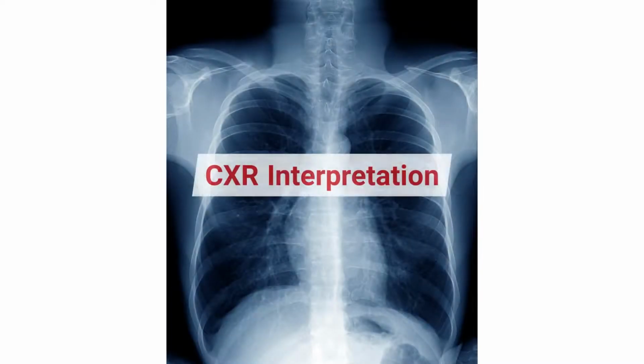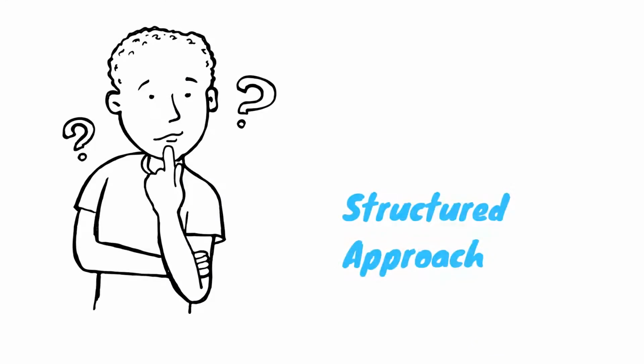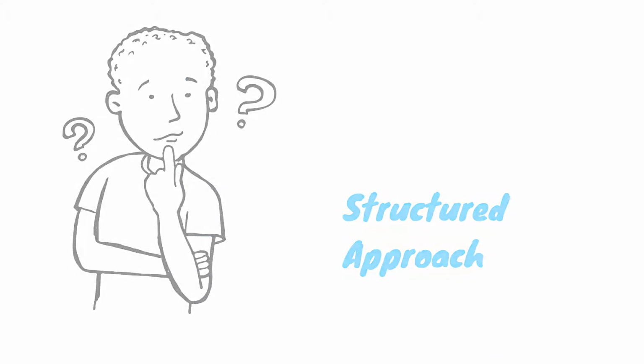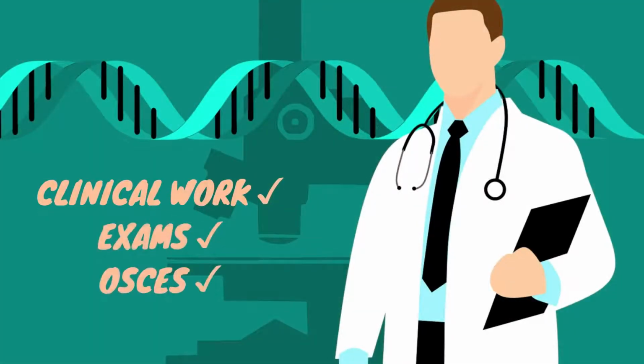Interpreting chest x-rays as a medical student can be quite overwhelming, but it's really important that you use a structured approach. Being able to interpret a chest x-ray is important as part of your clinical work, but you'll also be able to demonstrate in exams that you know how to interpret an x-ray confidently.